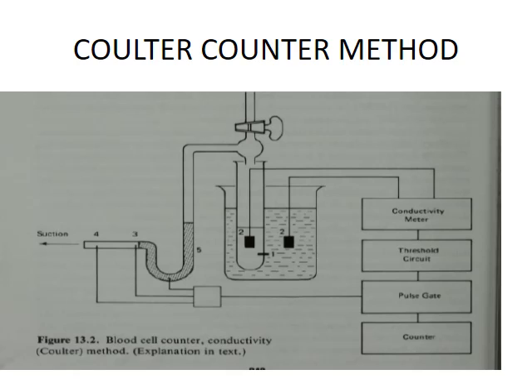The pulses that pass the circuit are fed to a pulse counter through the pulse gate. The gate opens when the mercury column reaches a first contact named 3 and closes when it reaches the second contact named 4. Thus, the number of cells contained in a given volume of the solution passing through the orifice is counted. A count is completed in less than 20 seconds. A DC voltage is produced which is proportional to the value of the count. This is one type of blood test.